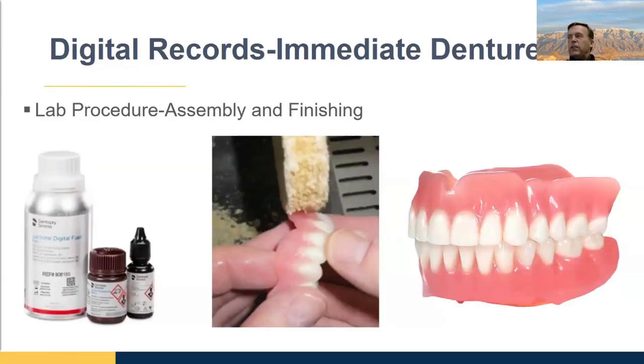So once the two pieces, let's say most of the laboratories these days that I'm familiar with are doing, print the teeth and print the base. We're getting really strong results, and it gives us maximum flexibility with tooth design. And if we're missing vertical and we have to make short teeth, we don't have to grind the teeth down, because you can't really grind printed teeth, but you can make the teeth the exact height that they should be.